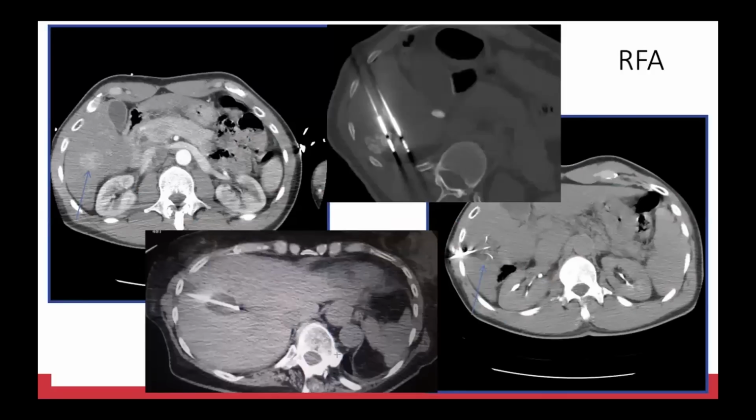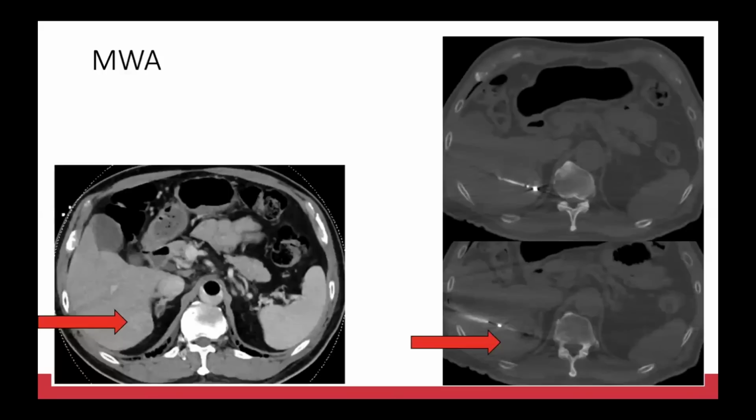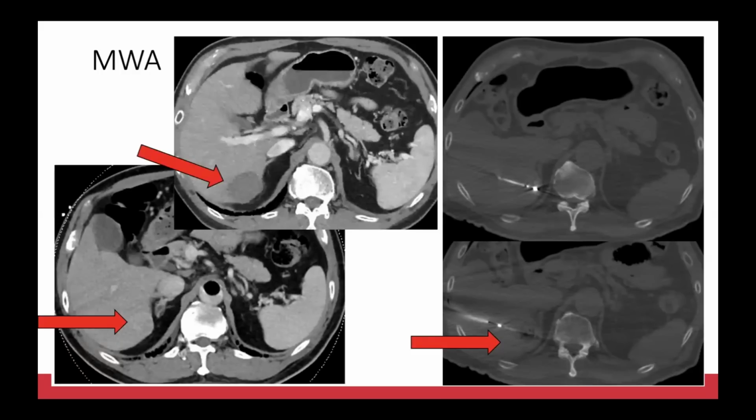Now, in contrast, the intratumoral therapies are becoming very widely used and very effective, particularly as a definitive therapy, whether it's RFA, which was the first treatment that we started in the United States, or microwave ablation. You target the tumor, whether under ultrasound, CT, or MRI, and then you advance this probe directly into the tumor and activate the heat or energy, whether heat, cold, or electricity, directly to the tumor, supplied by the antennas that you have. This has been an incredibly effective treatment. Of course, all of these therapies are operator dependent, right? So operators' expertise and experience come in, just like any other surgical procedure.